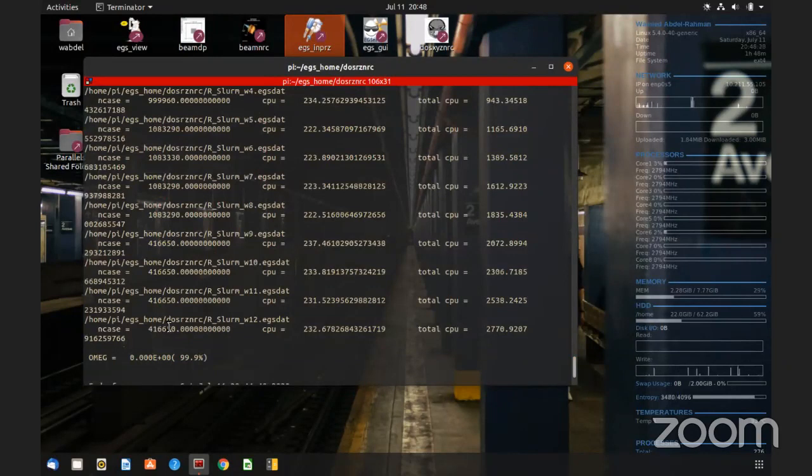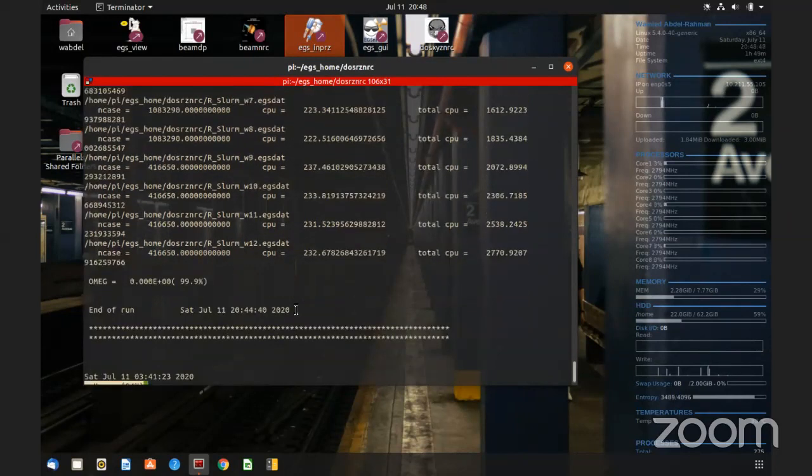So probably these four were running on the Raspberry Pi 3, the slower machine. But still, everything finished within the same time, roughly 232, 230. So this is the nice thing about this new feature of how they implemented the parallel processing.